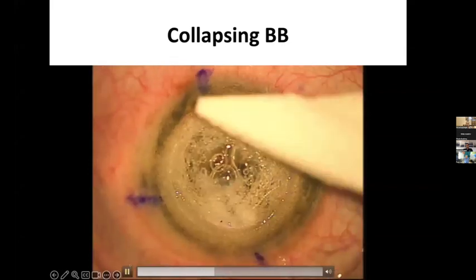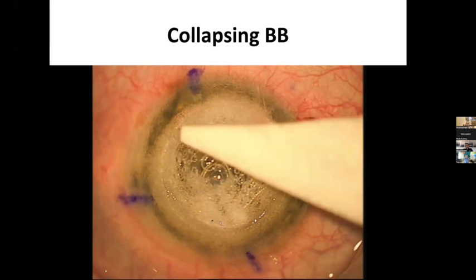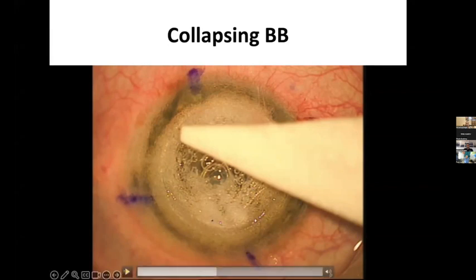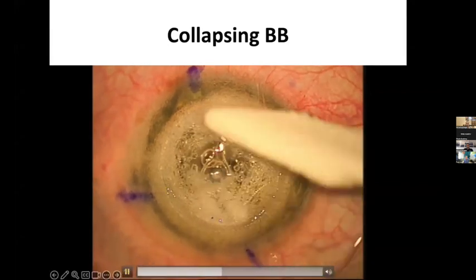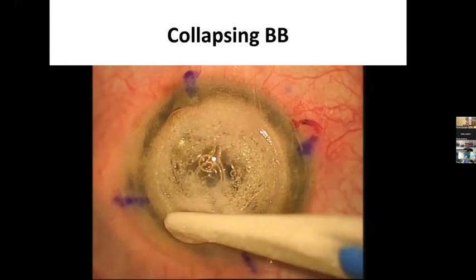You may inject viscoelastic in the same track instead of injecting air. Air will evacuate from the track of the cannula, but viscoelastic will remain, forming the bubble. So that's what I did.